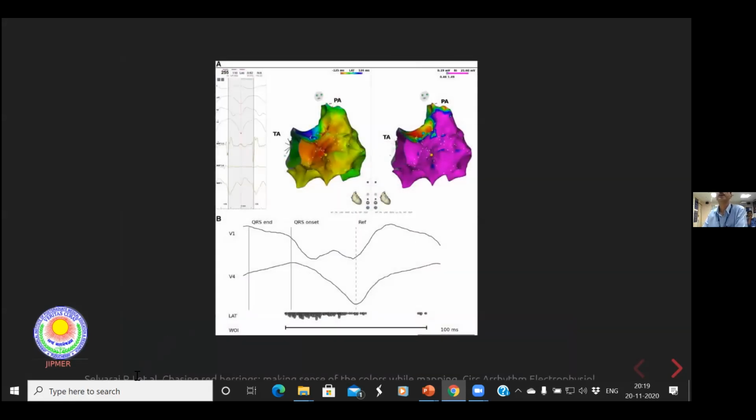So this point we had in one patient, which we previously published, was in a patient with tetralogy, where the point we wanted to make was, if you don't set the window onset early enough, we are mapping for the whole cycle length, but the window onset is not early enough, coming well before the QRS onset here. Early points can fold back and be marked as late points. And then if you just look at the map, you'll think you're mapping the whole cycle. And on the colors, you will see head meets tail, and it'll look like re-entry. So a focal arrhythmia can look like re-entry if you choose the window badly.